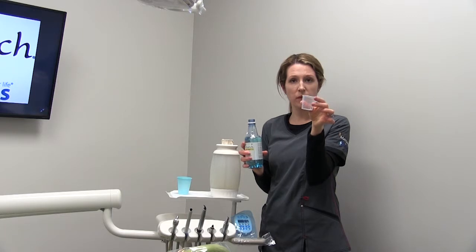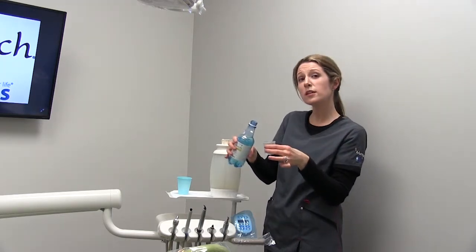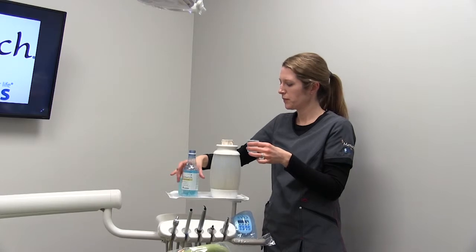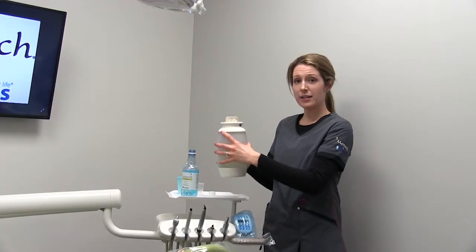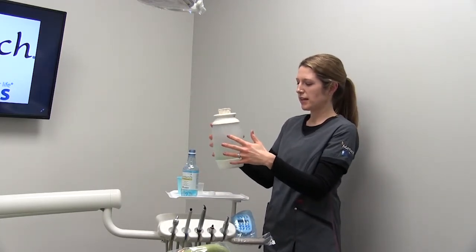There is a cap that comes with it — it's the measuring cap for two ounces. There's no need to dilute. Pour it directly into the bottle. I like to shake it around so that it evenly cleans the inside of the bottle as well.